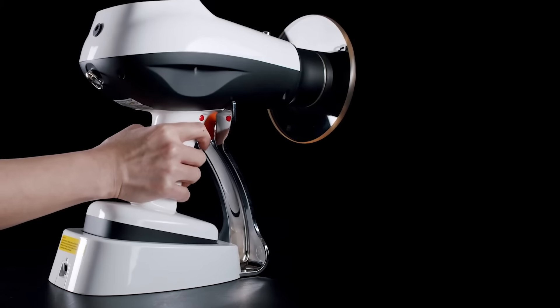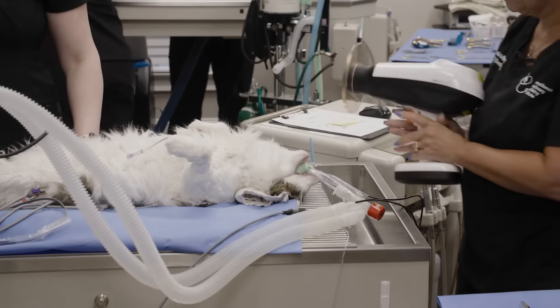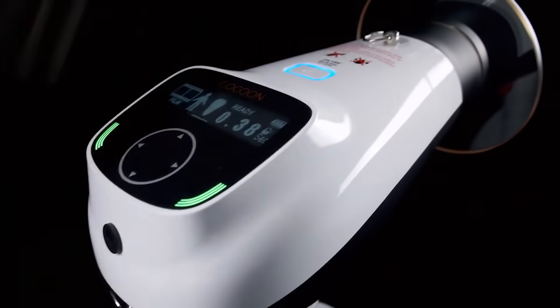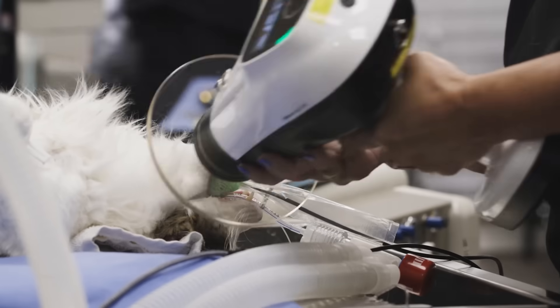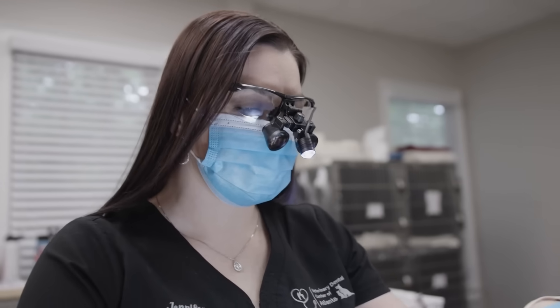We have tried everything on the market for the last 25 years and nothing compares to the Cocoon. The Cocoon is a point-and-shoot handheld generator, significantly lighter than other point-and-shoot handheld generators out there that we have used in the past.